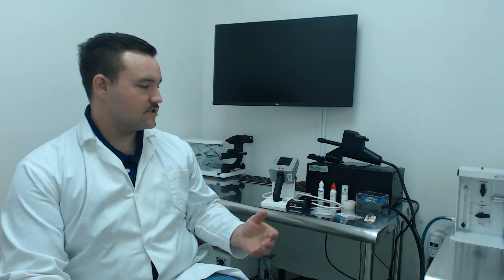We will be performing an ERG on a dog without sedation, as this can be one of the trickiest ERGs to perform. The first thing you will want to do is make sure you have all of the necessary items set out that you will need. We will also provide a list so that you are able to take a picture and know exactly what items we are using.